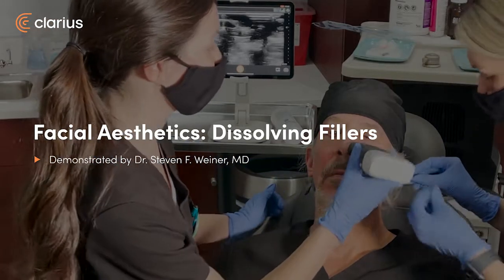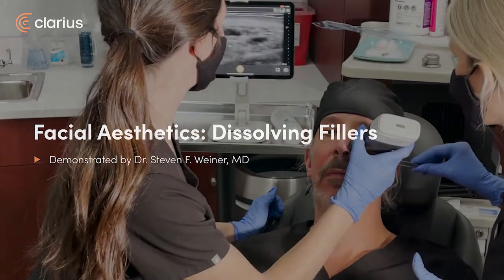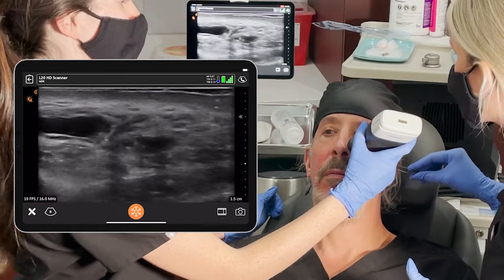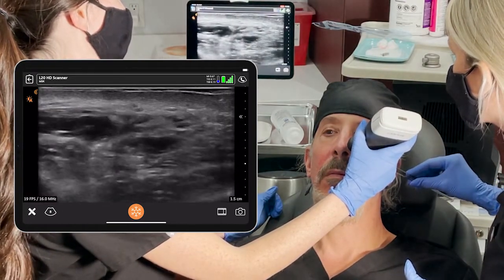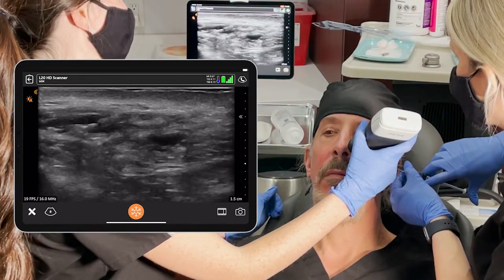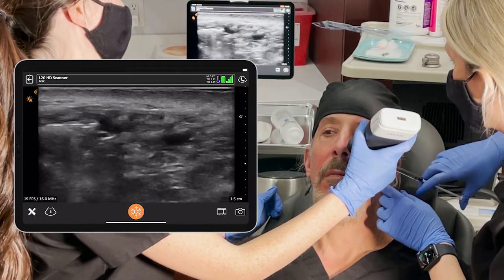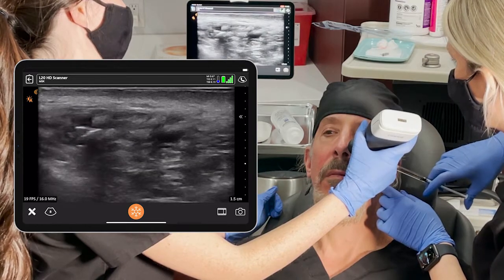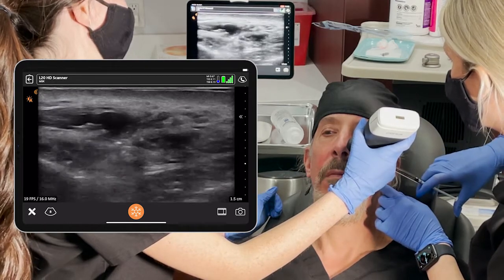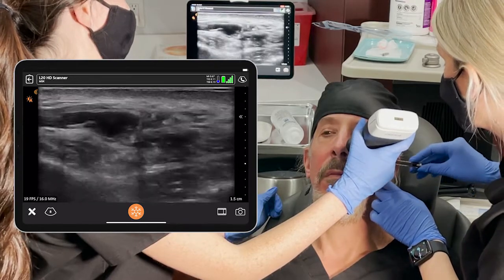I have a nurse on the left and my PA on the right. The nurse on the left is going to identify that pocket of HA, and we're using a cannula here. Keep in mind that I tried injecting this blindly with hyaluronidase, and there was no difference in the pocket. I think sometimes these form a little cyst or pseudocyst with a wall around them — that's why some people come to me saying they've been injected four, five, six times and still have this nodule or swelling related to their prior HA.